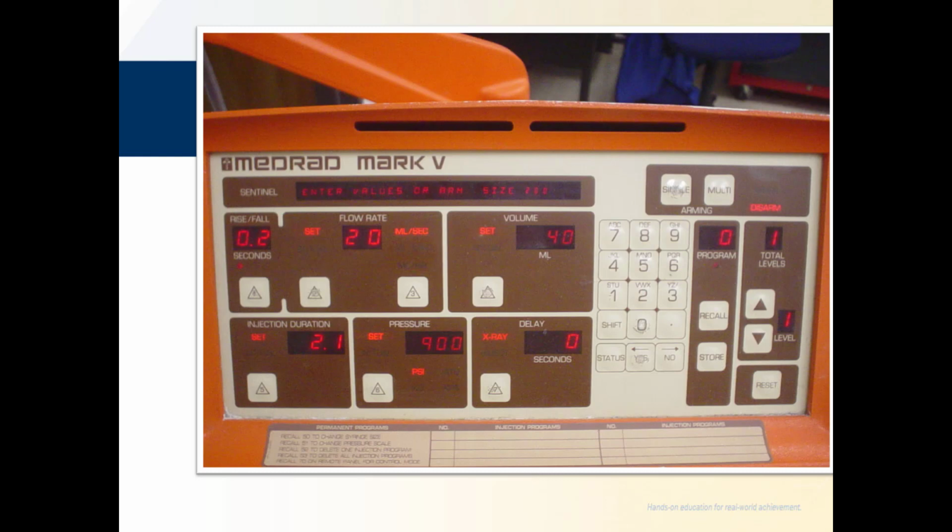Here's a control panel of our unit that we have down in our simulation lab. Yes, it's from the 1970s, actually from the 90s. You can see here it's nice bright orange, and we'll go through and take a look at the panel. Okay, so here we have rise fall. What you do is select the delta, and this is going to start blinking right here, this little light. You would come over here and go 0.2, hit the delta again, and it sets it.